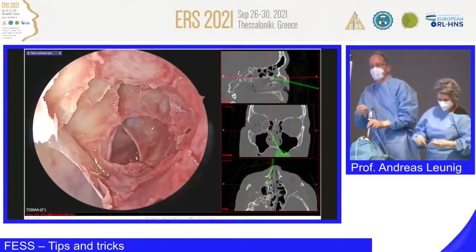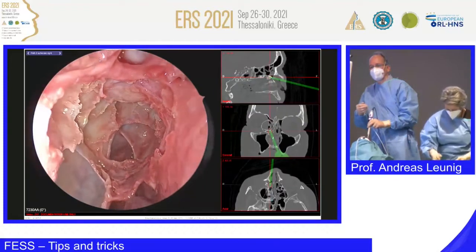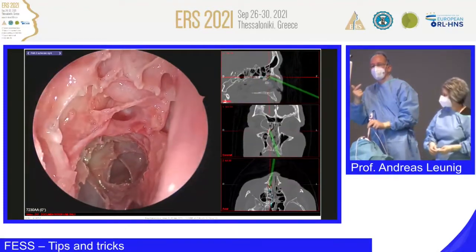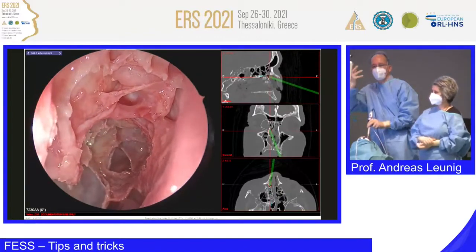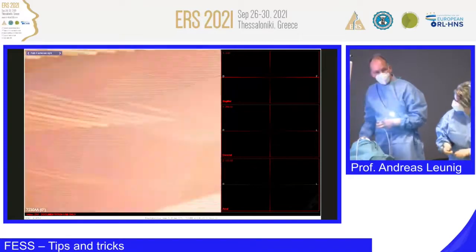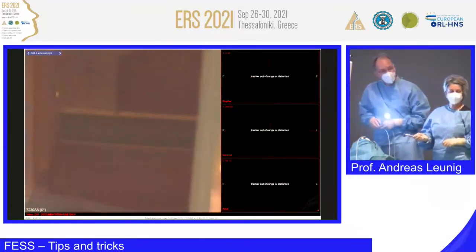So, well, this is posterior ethmoid, it's exposed. Yes, you can polish a little bit more. But now I think we should go up to the frontal, and there are some bony structures still in place. We are switching to... Sorry?